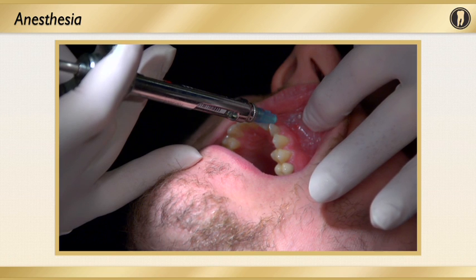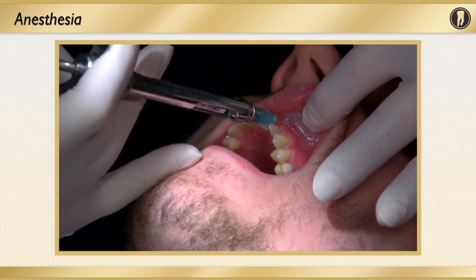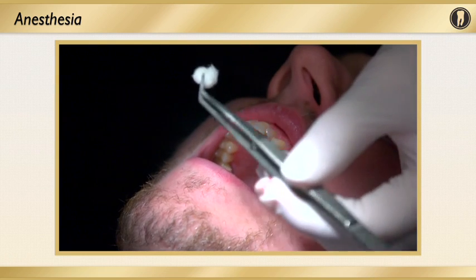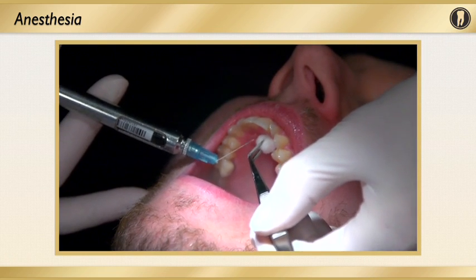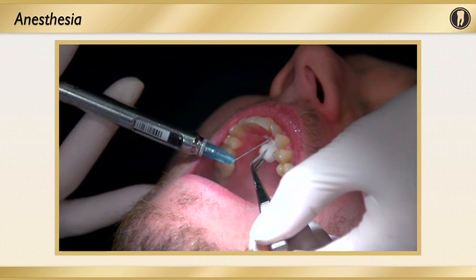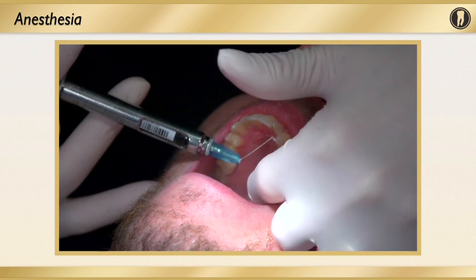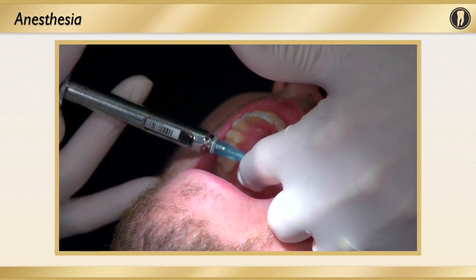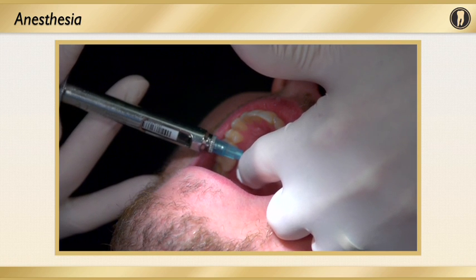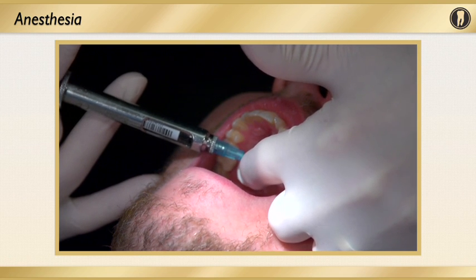I'll take a small or medium-sized cotton pellet, and I'll spray endo ice on the cotton pellet, saturate it, and then place it right where I'm going to inject on the palatal tissue, and I'll freeze the tissue a little bit. Then I'll remove the cotton pellet and put the needle right in that white circle. This numbs up the palatal tissue because this injection hurts. But I'll give about 1/8 of a carpule of the palatal injection of the lidocaine.